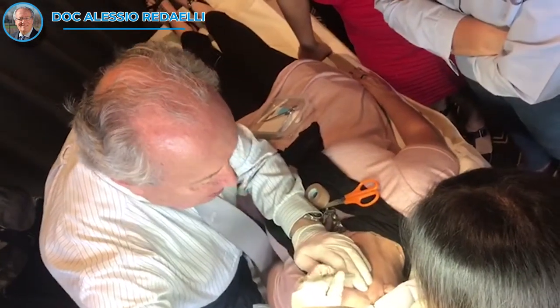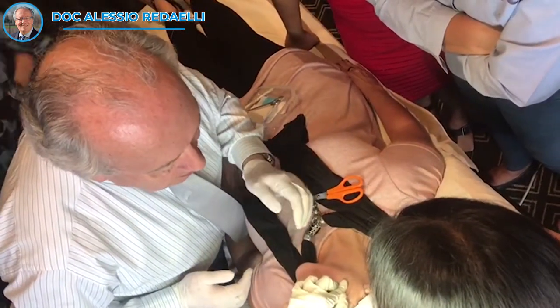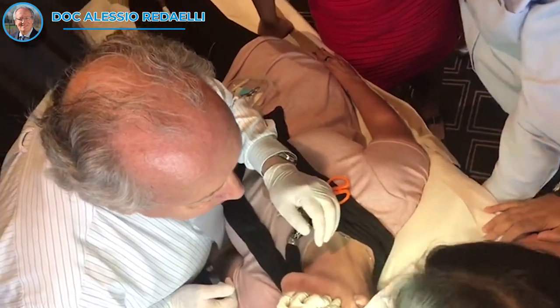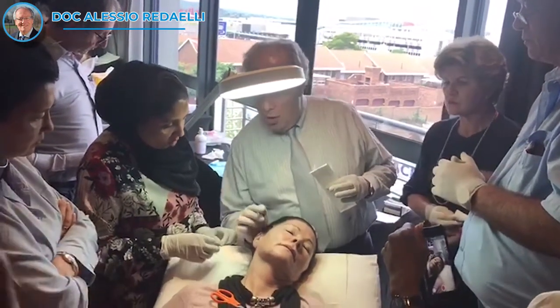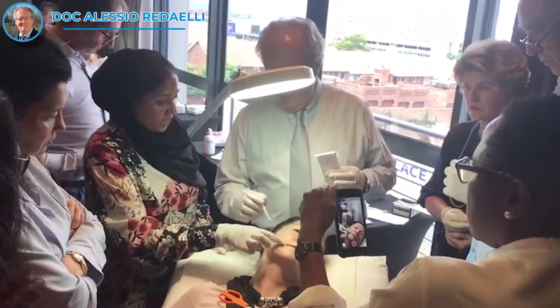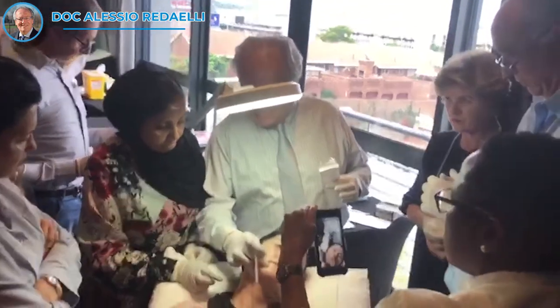Now you charge it, and you exit, exit, exit. It's gone. You enter this way, then you turn and you go up — zygomatic. You don't have to arrive here, but here, so that you pass this.